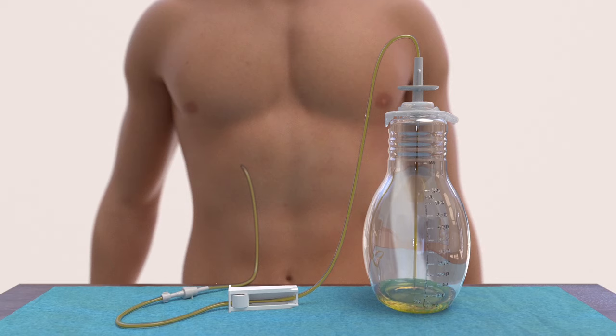The drainage bottle features a drainage line which you will connect to your catheter when you drain. The color of the fluid drained may vary.